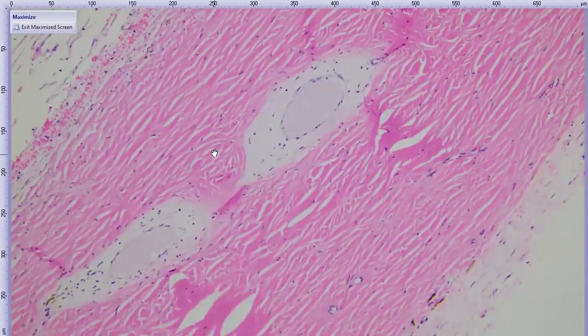And so we see this material in feline open angle glaucomas. And so I think that's what was going on in this case, that the cat has primary open angle glaucoma based on this stuff. Even though they said no glaucoma clinically, we definitely have glaucomatous changes in the retina and the optic nerve.